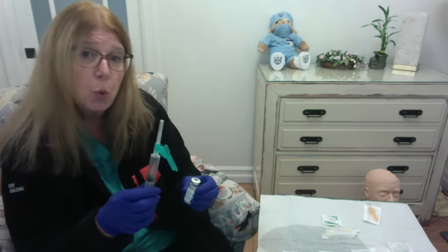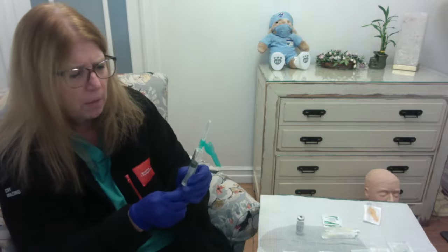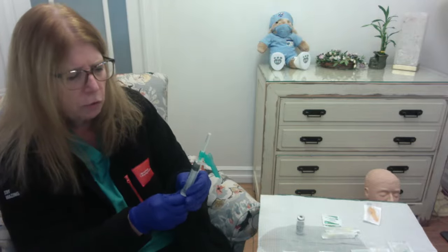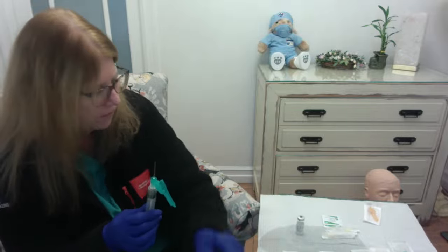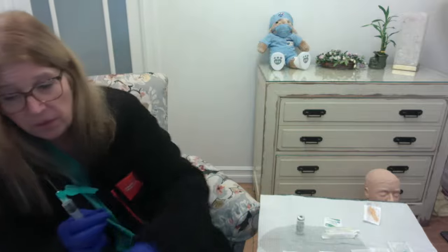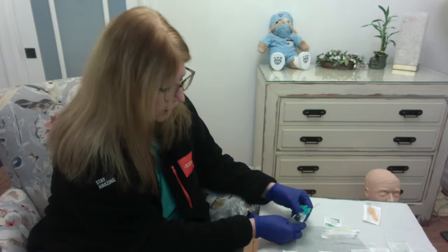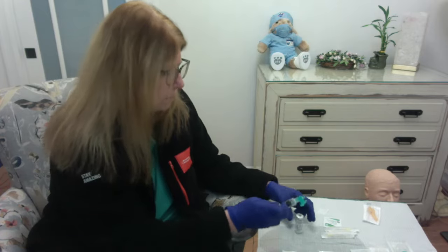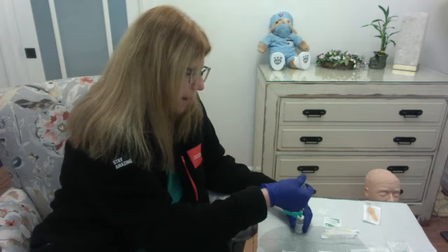So I only need 2 mLs, so I can use this same syringe. I'm going to go up to my 2 mark. Okay. I'm going to take my cap off. I'm going to clean the top of this vial again with my alcohol for 30 seconds. Okay. I'm going to go into the bullseye, put my air in.